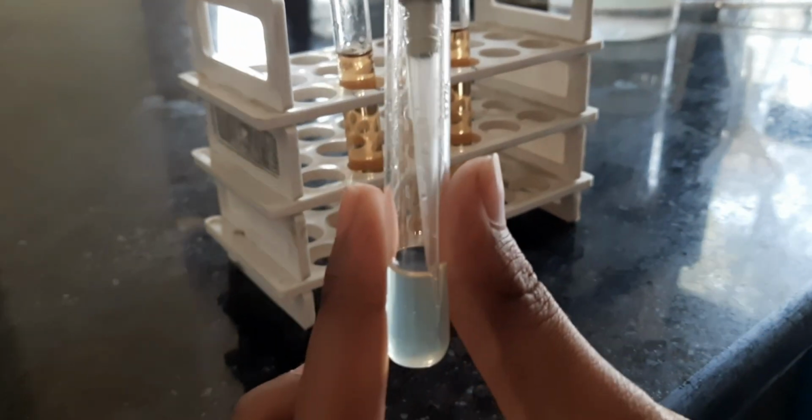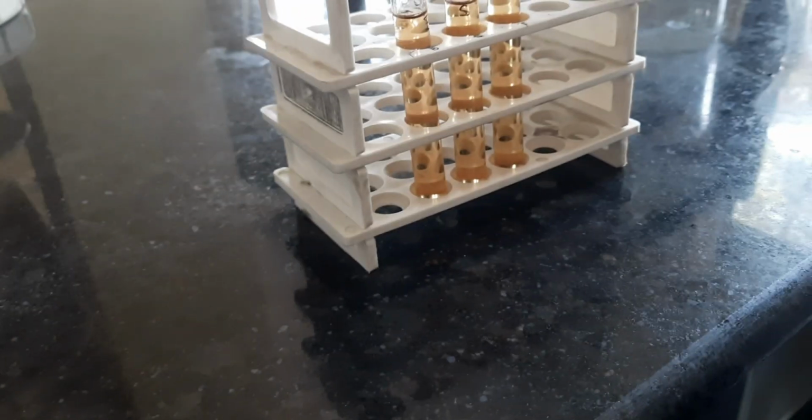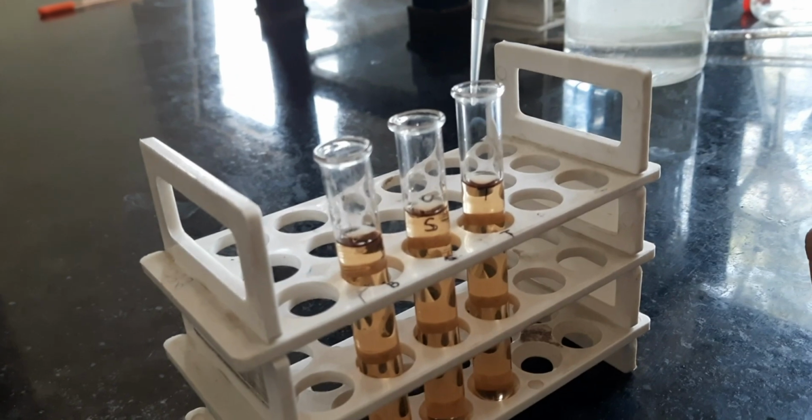Next, we will be taking our serum sample and taking up 50 microliters of it with an autopipette and putting it into the test tube labeled as test.